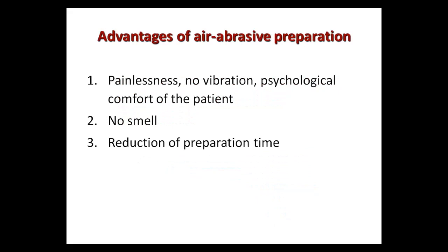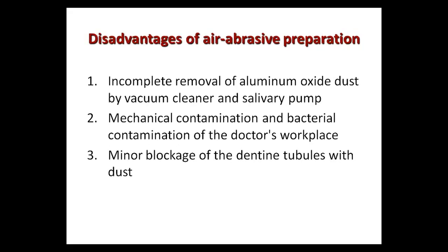Advantages of this type of preparation: it's painless, no vibration, psychological comfort for the patient, no smell, and reduction of preparation time. It's faster.